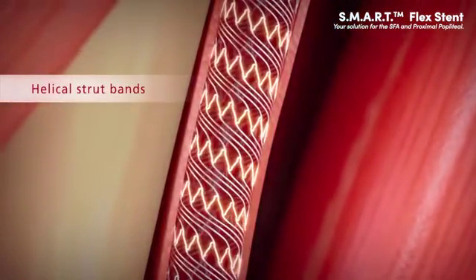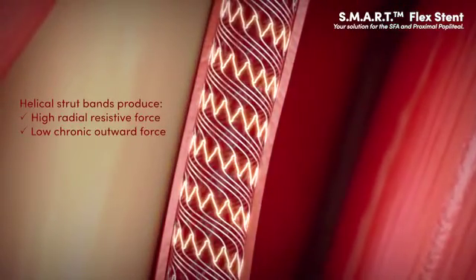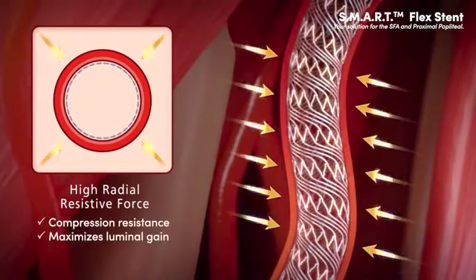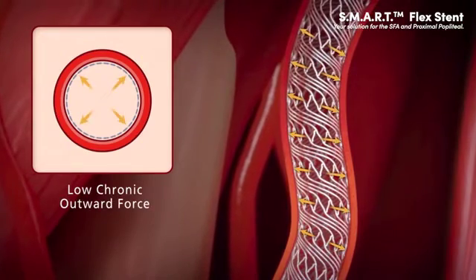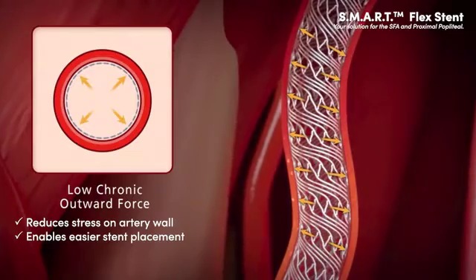SmartFlex helical strut bands and diameter-specific design produce high radial resistive force and low chronic outward force. High radial resistive force provides the ability to resist compression and maximize luminal gain, thus enabling increased blood flow. Low chronic outward force reduces stress on the artery wall and enables easier stent placement.